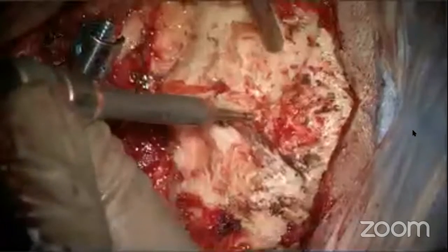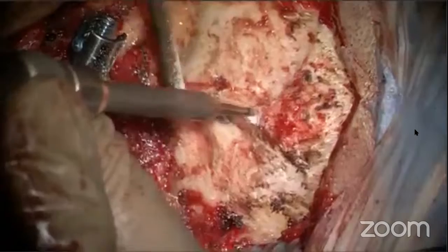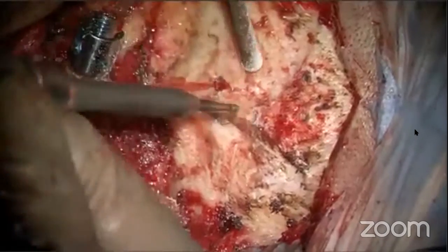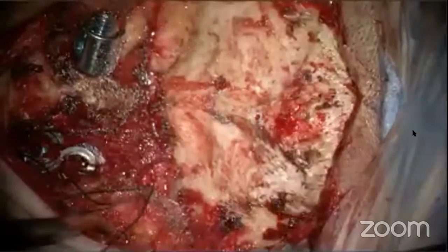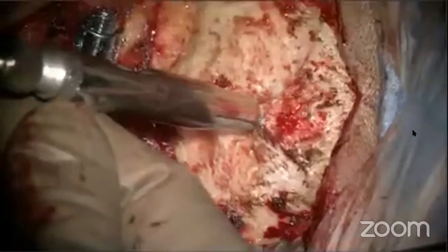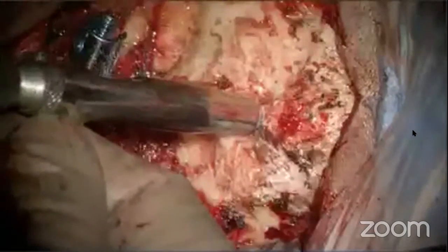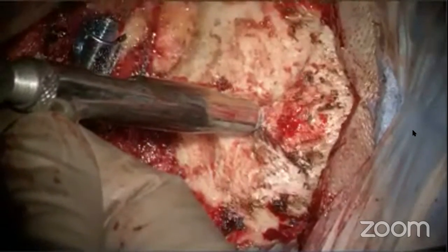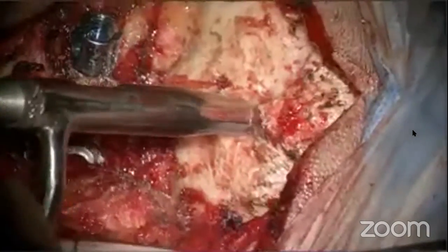Then mark the site of the topmost screw just underneath the EOP in the midline. Using a 3 mm burr, make an entry in the outer table of the skull. Then use a drill bit through a drill stop. The drill stop does not allow the drill bit to go beyond the measured distance. For the first pass, we have set the drill stop at 6 mm.